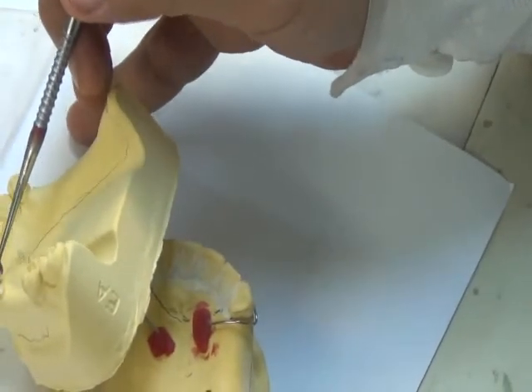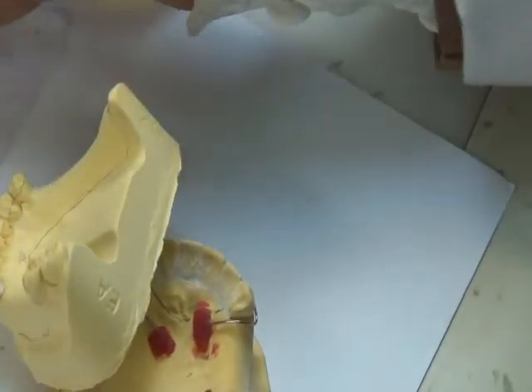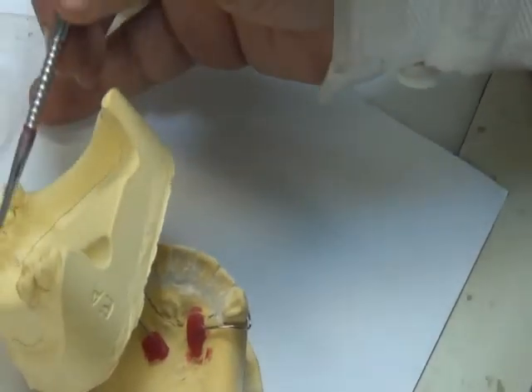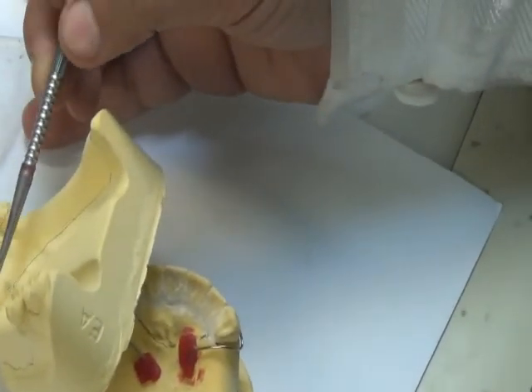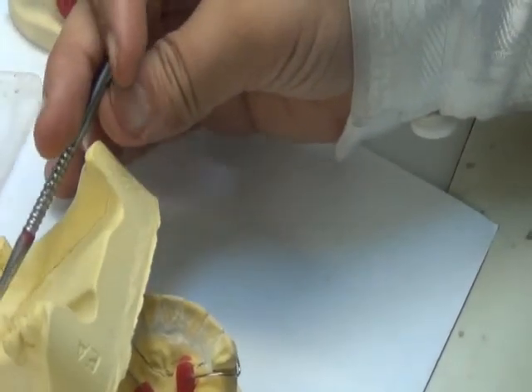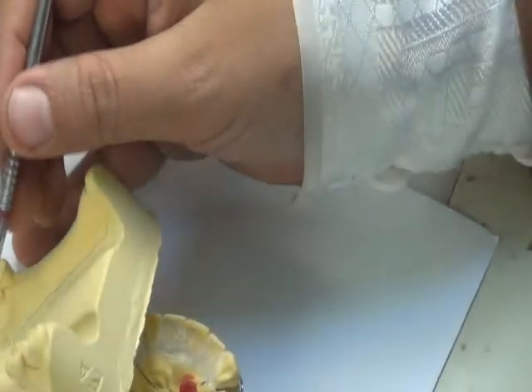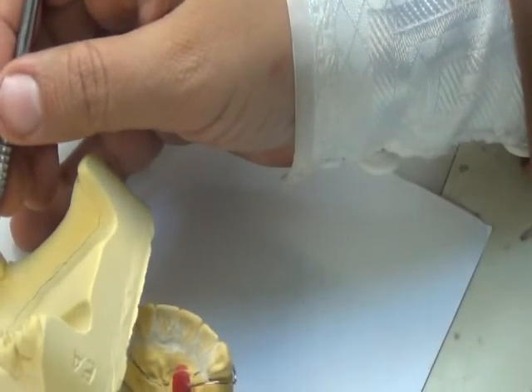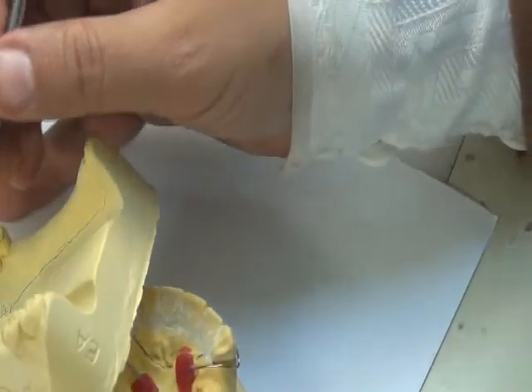We also put it on the lingual side, because on the lingual side the solid acrylic is also coming in contact with the teeth. So we call it parallel blockout, once more because it's parallel to the path of insertion. We added the plaster also lingually.